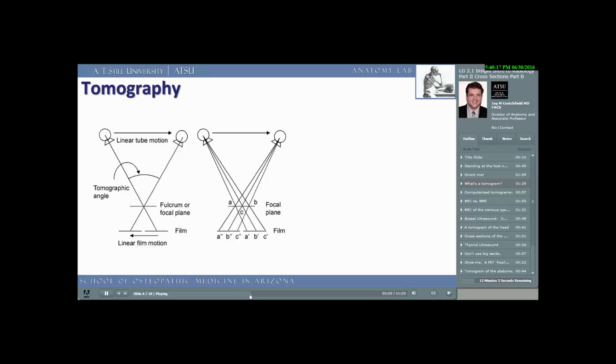Have you ever looked through the eyepiece of an expensive camera and noted the camera was focused on the faces of the family while the background was blurred out? It's the same idea. If we do this, and we do this hundreds of times a second rapidly, we find that we can image structures using a computer, generating thousands of images, thousands of pixels.